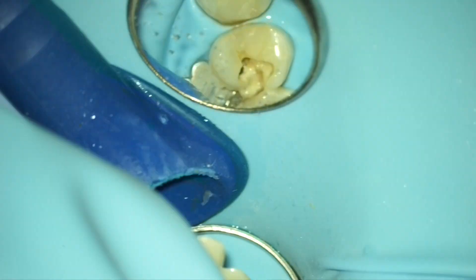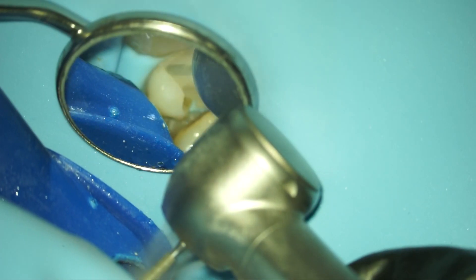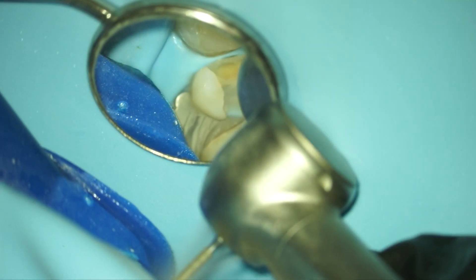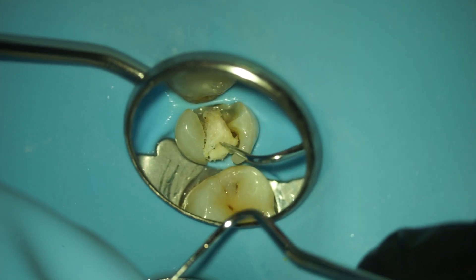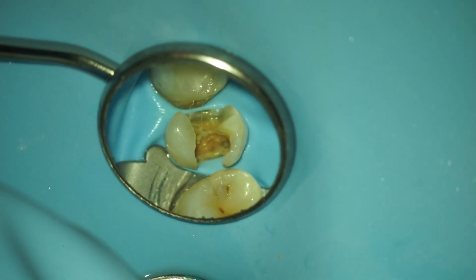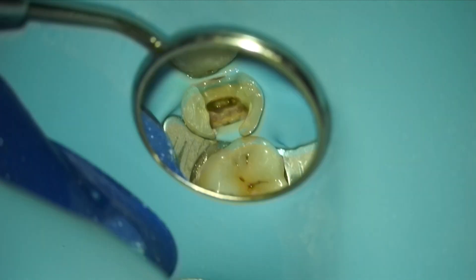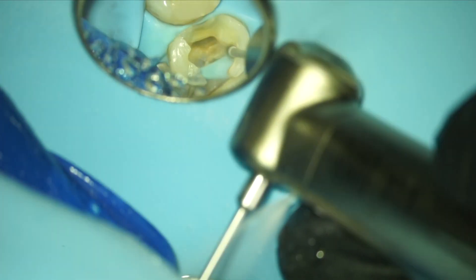In this part you can see me removing the caries and of course removing some of the old restoration — I sped it up a little bit. Here I'm removing the old cotton pellet. It's a mystery to me why dentists still use cotton pellets. After removing them, I am reducing the cusps. Especially if you have a premolar with an MOD cavity, it's important to reduce the cusps — otherwise it will fracture for sure.